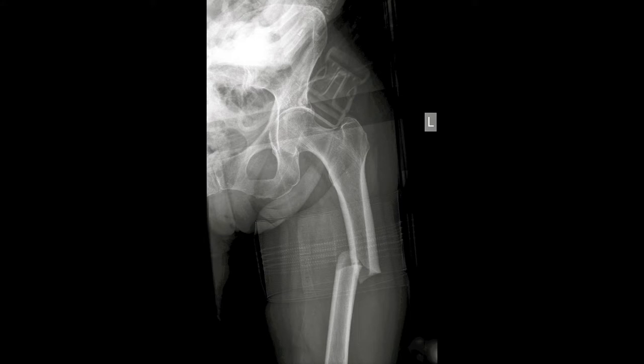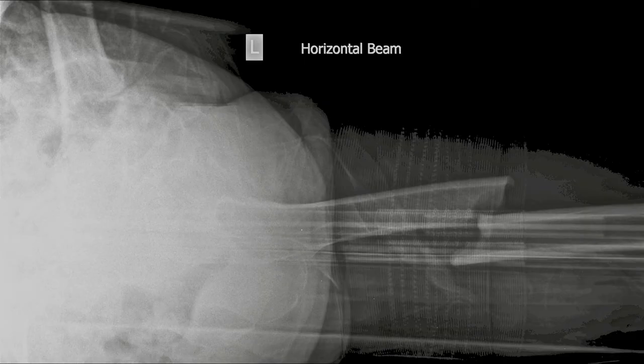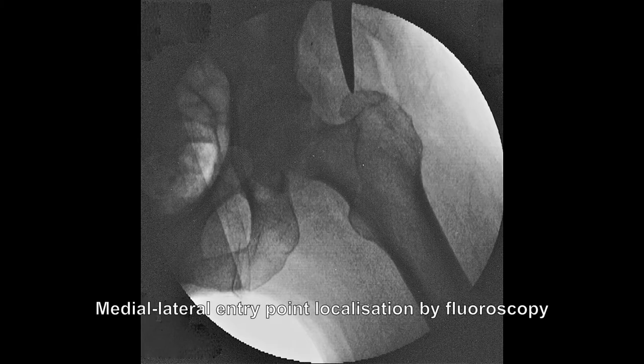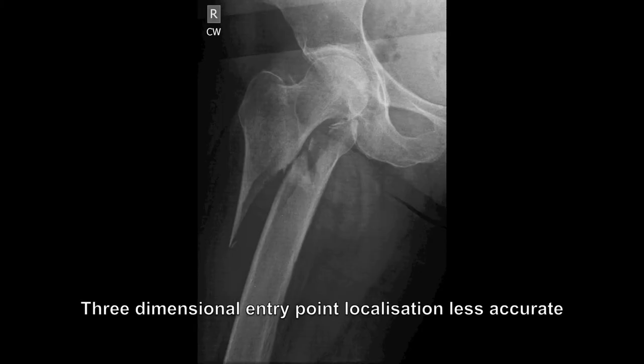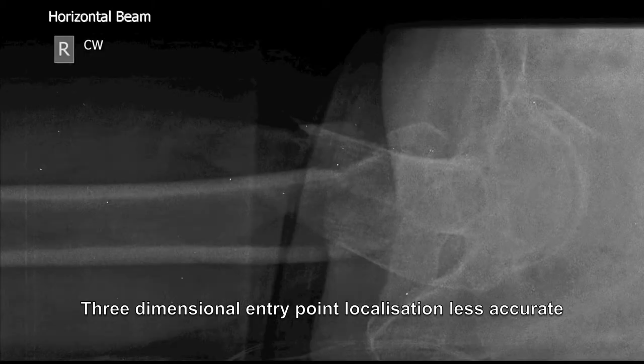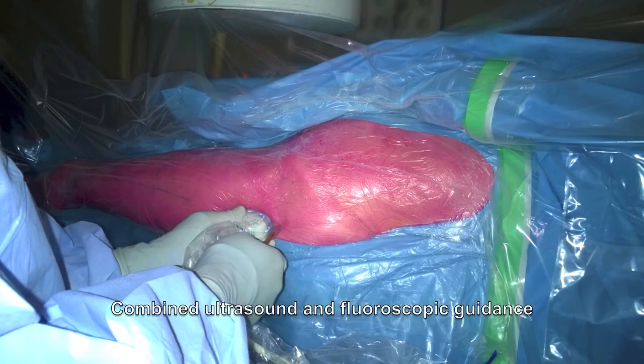For fractures of the femoral shaft where the proximal femur has minimal deformity, accurate localization of the proximal femoral entry point can easily be obtained by a combination of intraoperative fluoroscopy and direct palpation. In situations of patient obesity or complex fracture deformity, we have found intraoperative ultrasound useful in the accurate three-dimensional localization of the nail entry point.